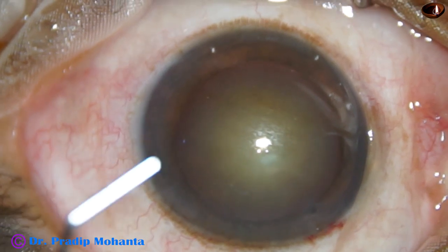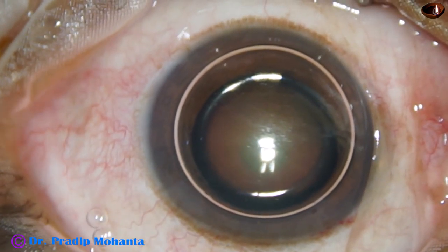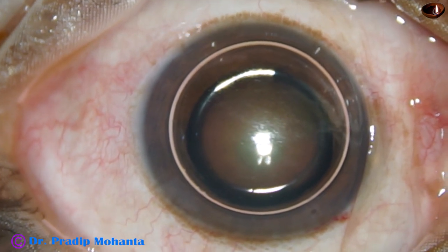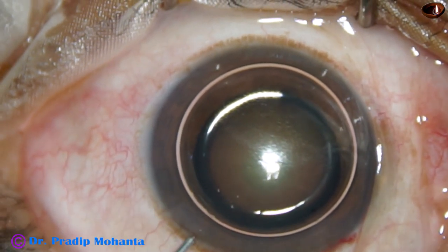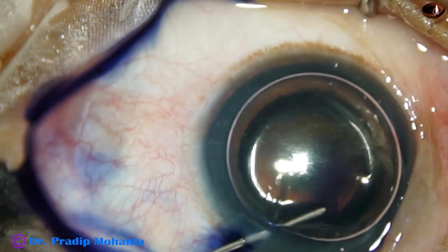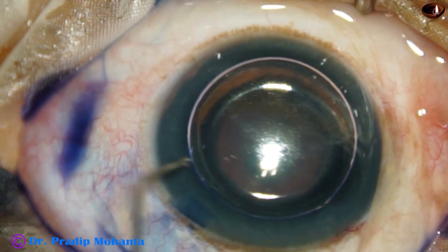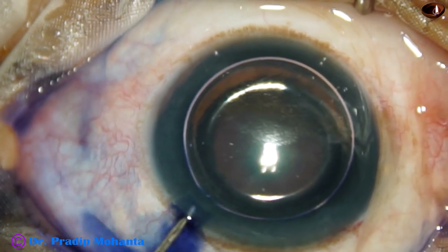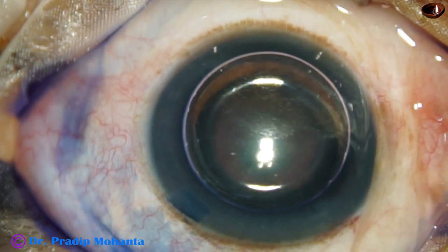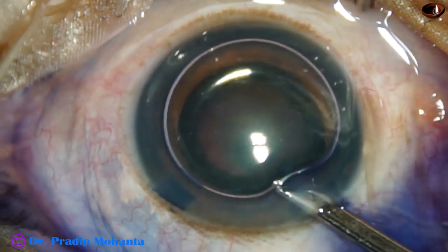In this case, only one side port has been made. An air bubble is then injected, and beneath this air bubble, Trypan Blue 0.06% dye is applied over the capsule in such a way that the dye touches all parts of the capsule. Now the dye is washed out.